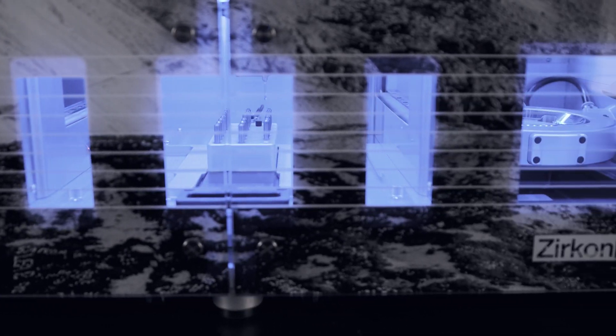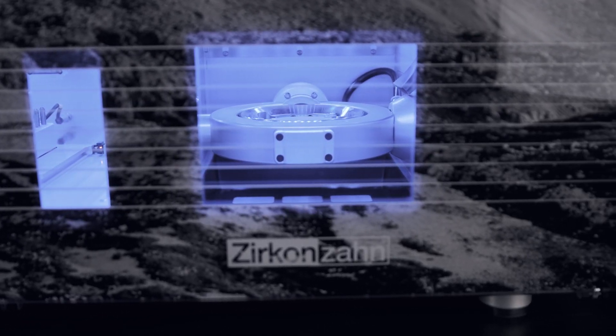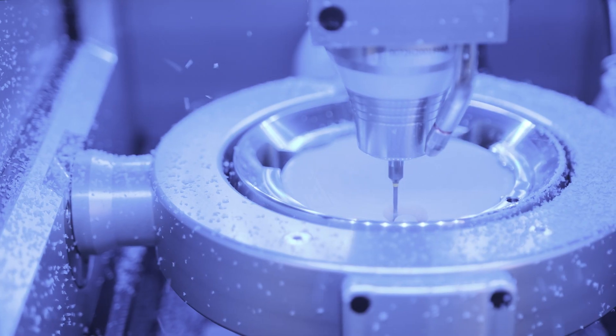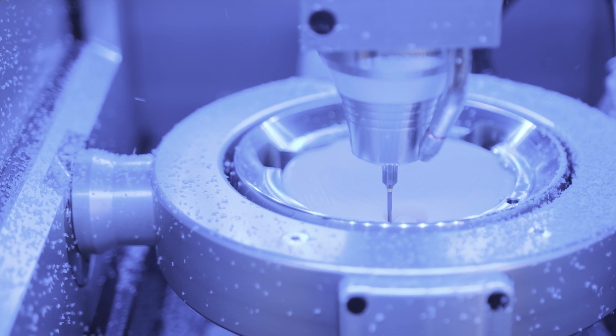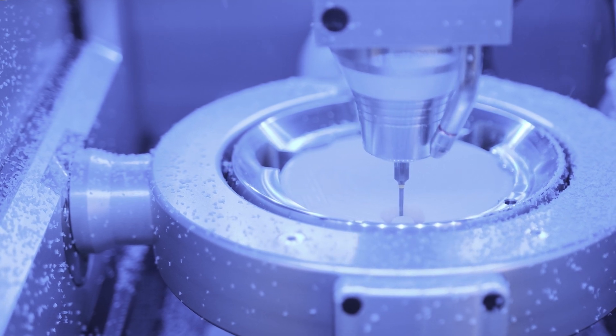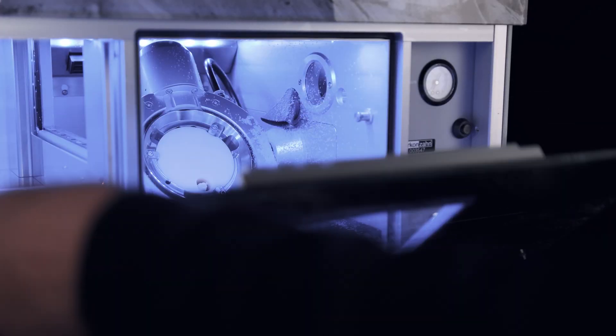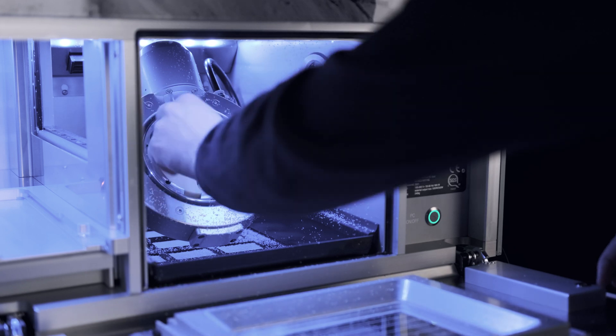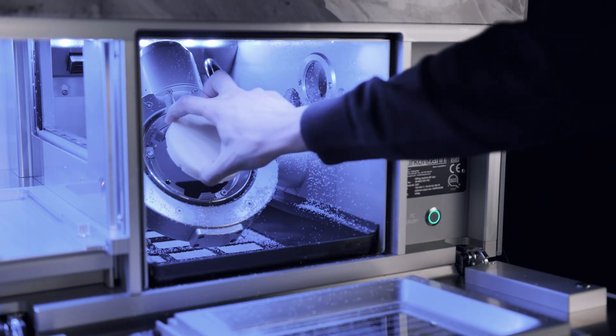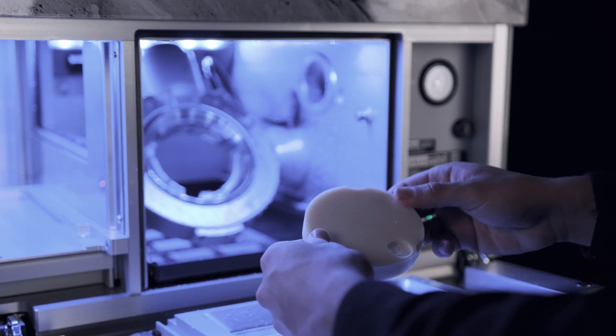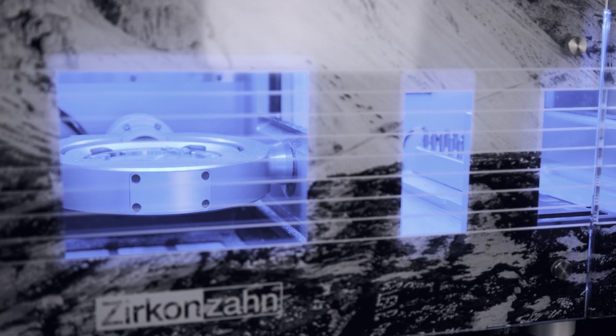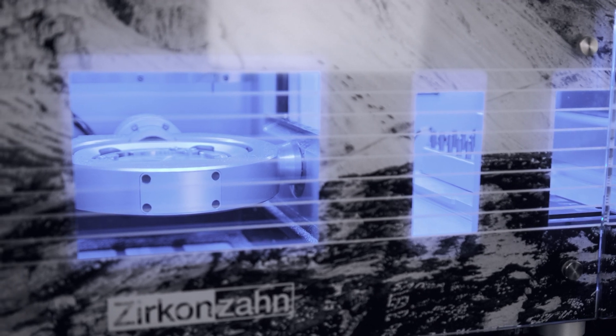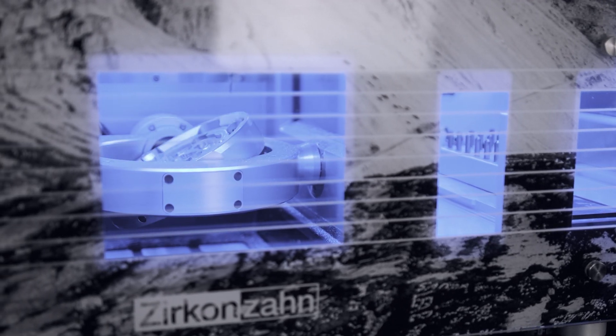You can stop a milling process in one chamber and start a new one in the other. As soon as the process is finished, the spindle automatically returns to the chamber where the milling process was previously interrupted at exactly the same position to complete the program.